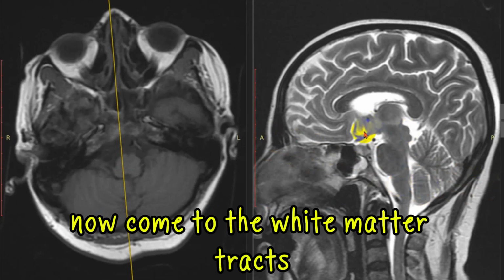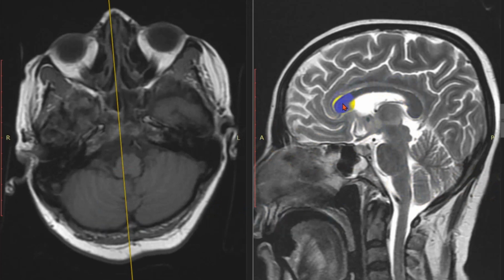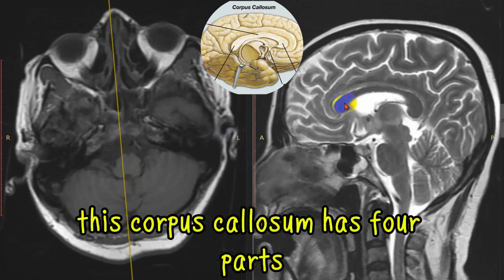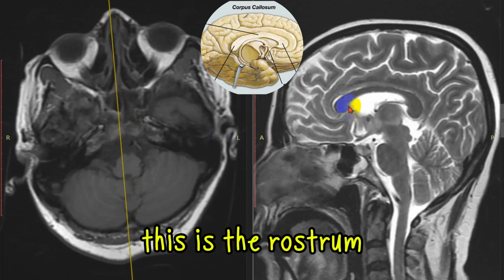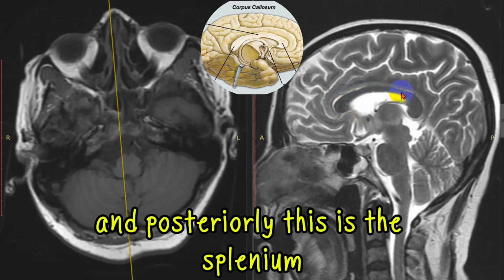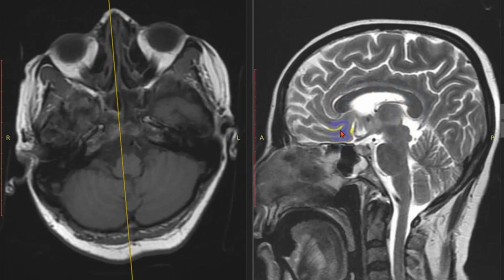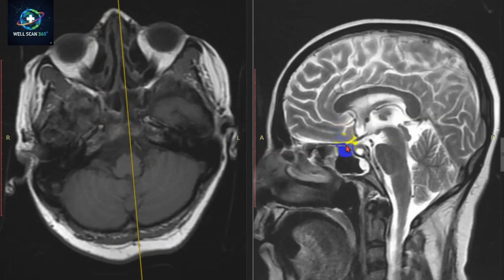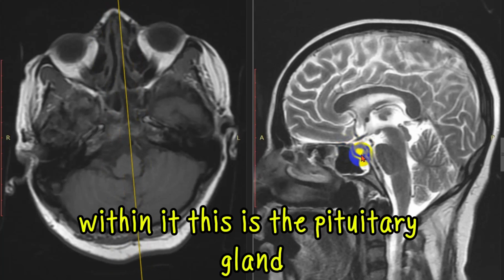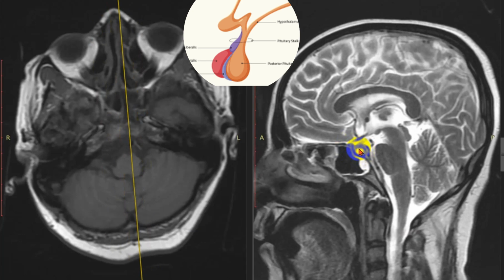Now come to the white matter tracts. This is the corpus callosum, which connects the 2 cerebral hemispheres. This corpus callosum has 4 parts. This is the rostrum, this is the genu, this is the body, and posteriorly this is the splenium. Now come to the pituitary. Here we can see this is the sella turcica. Within it, this is the pituitary gland.